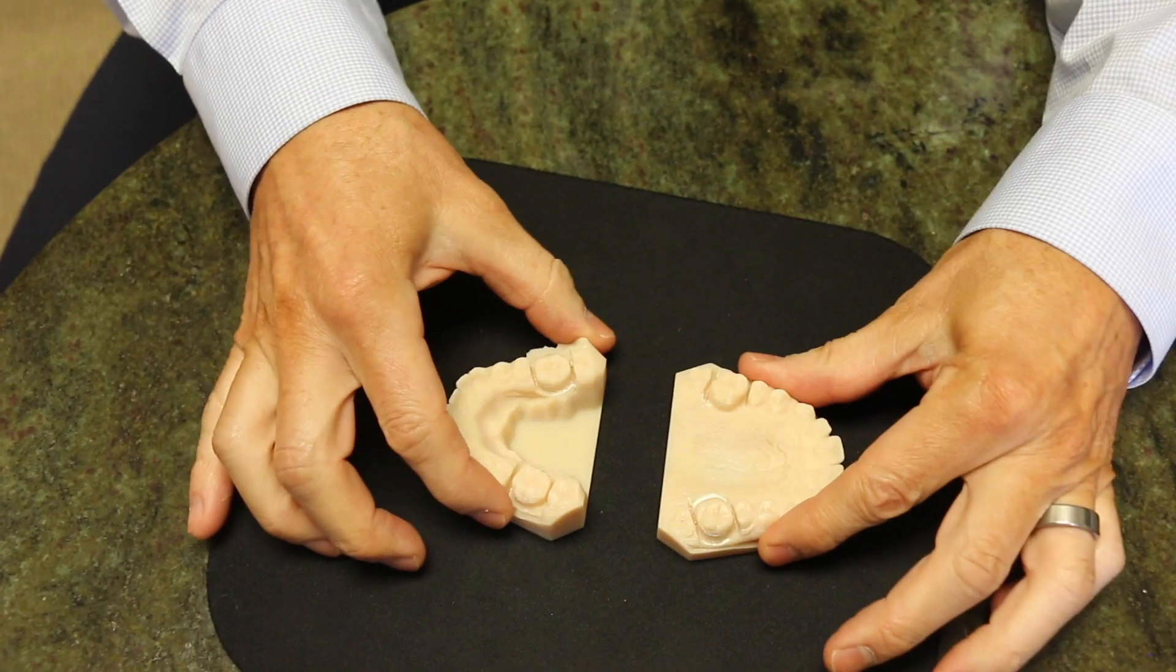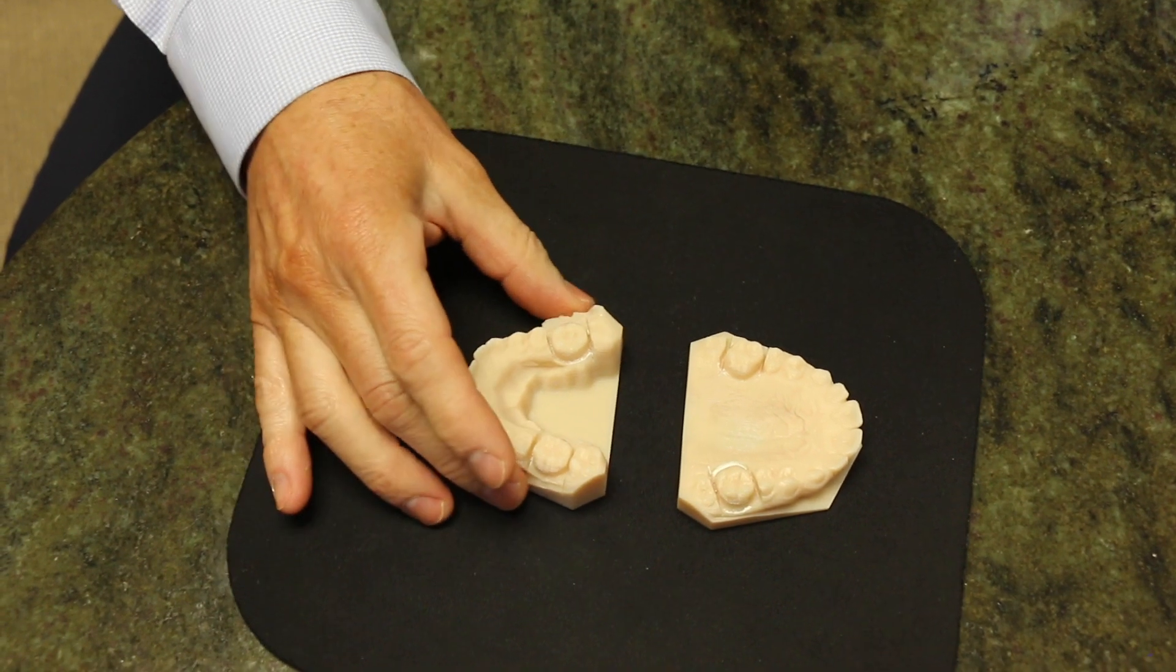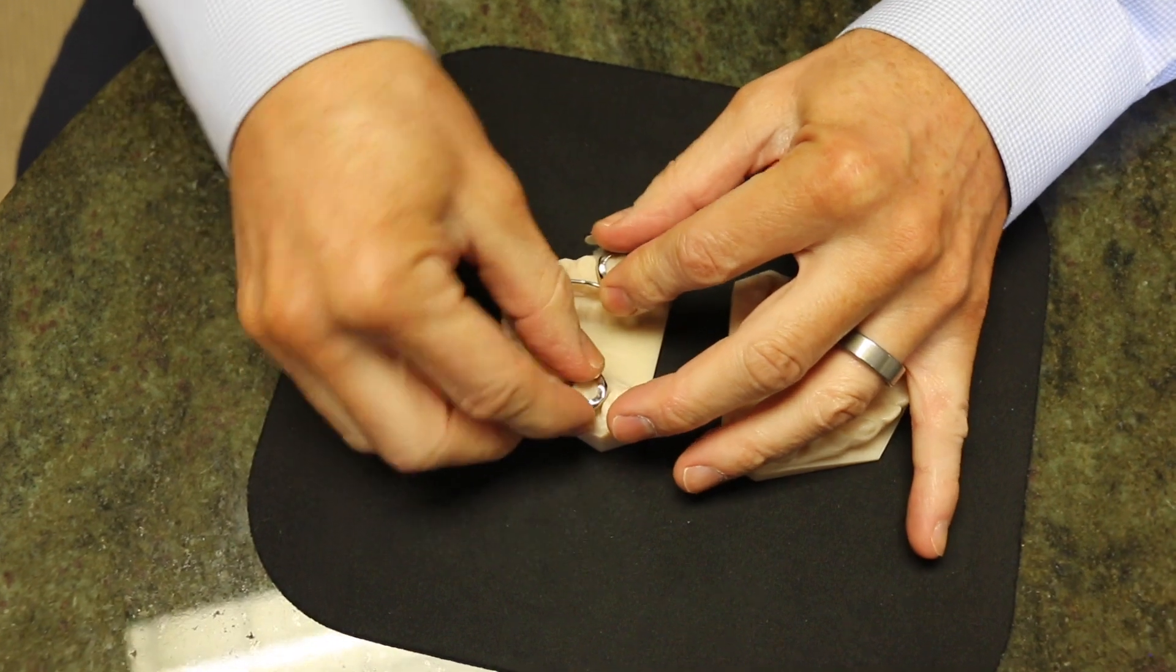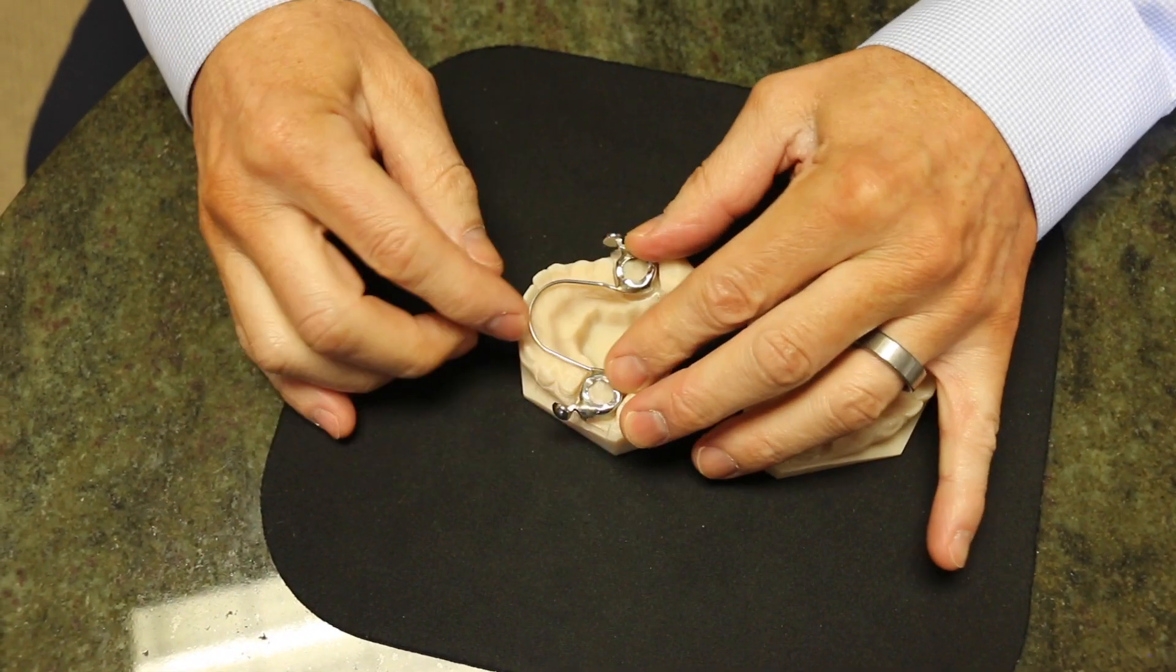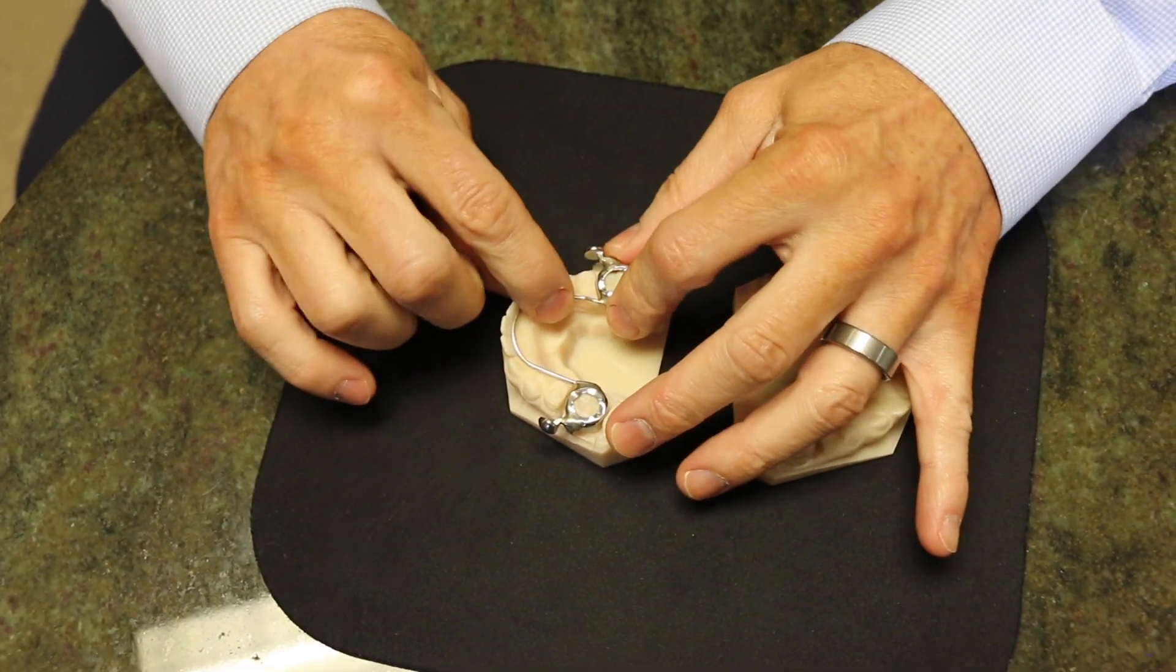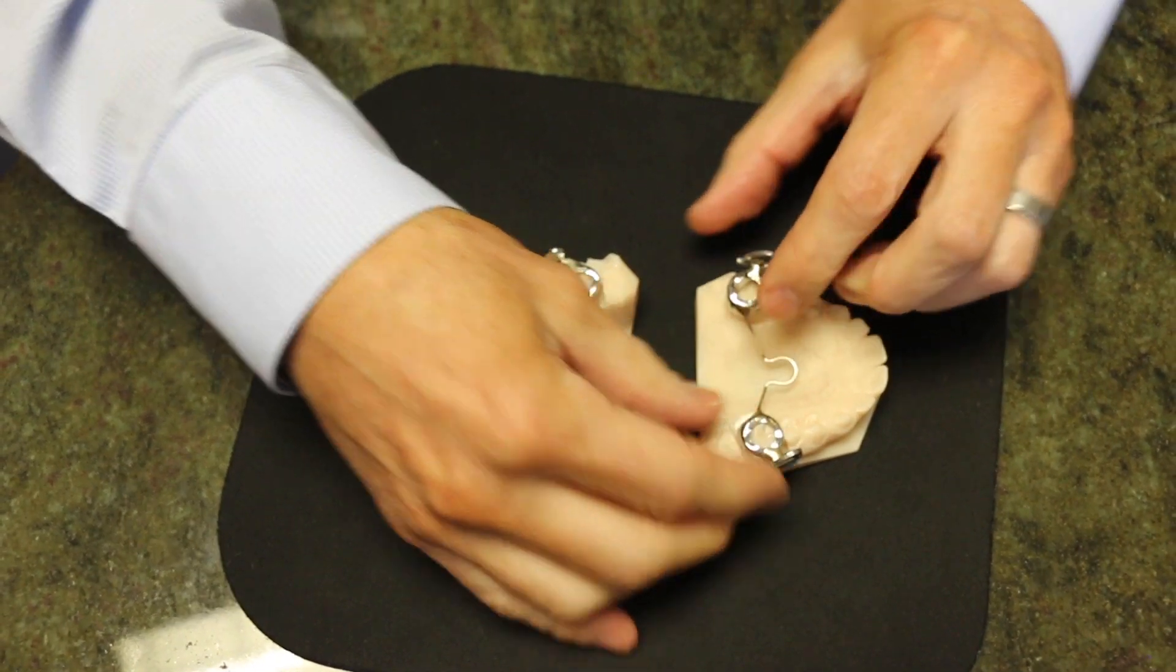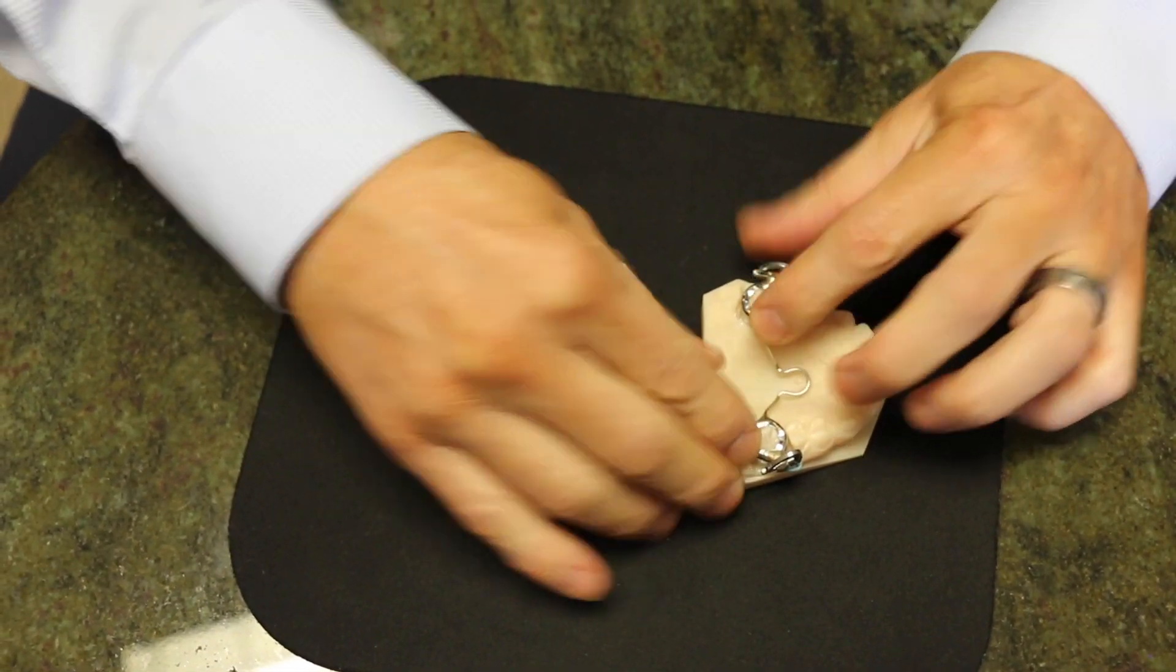Instead what we do for patients like this who are still growing is we use a special appliance called the MARA appliance and it comes in two parts. One part fits over the bottom teeth, fits over the bottom molars with a little wire that extends forward and rests against the back side of the front teeth, and then there's another part that fits in the roof of the mouth like this.